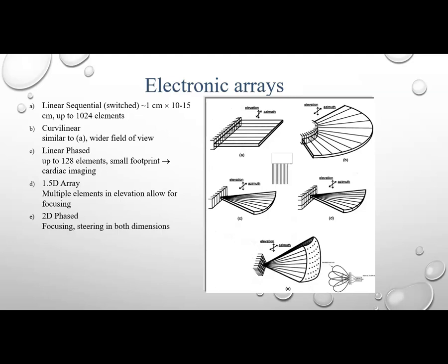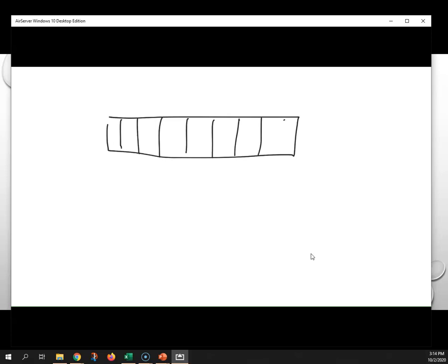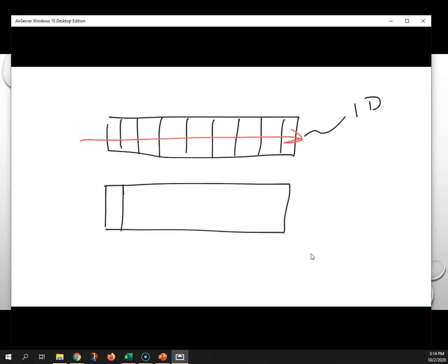Alright, so a regular flat linear array transducer just consists of a flat thing that's been cut into subcrystals, right? You may have heard this before. That's called a one-dimensional array transducer because the crystals are in a row in one dimension, one right after the other. A 1.5 dimensional array transducer is essentially the same thing. It's cut this way, but then they go in and make a couple extra cuts to it, and they'll cut little smaller crystals front and back.